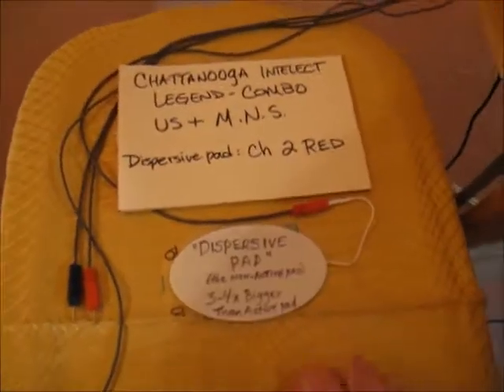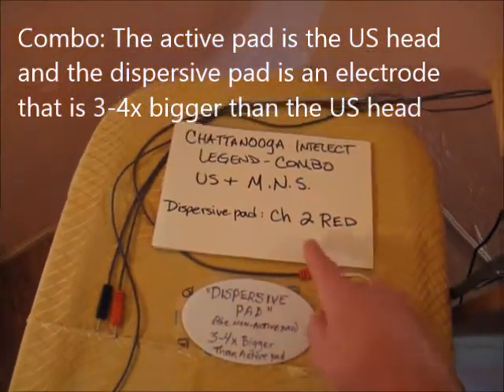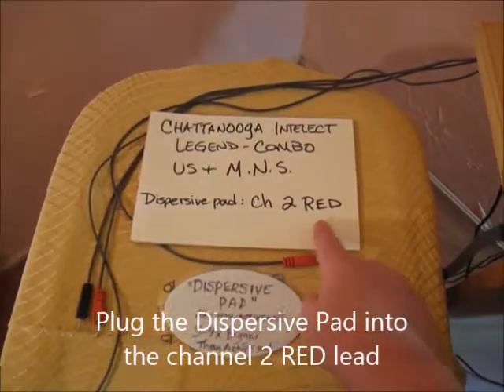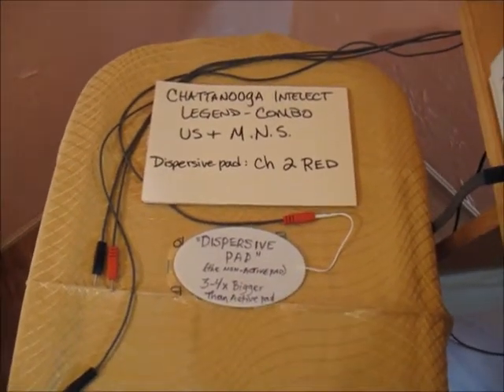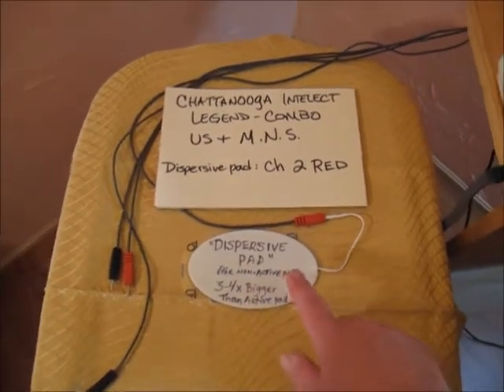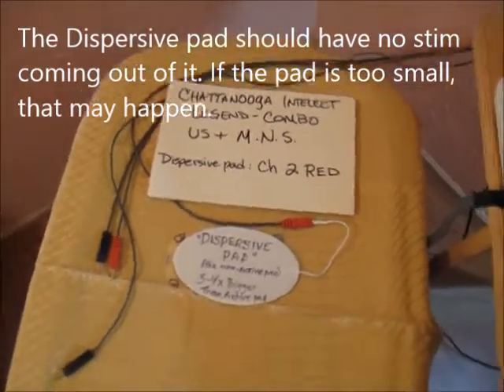Now set up the pads. The only pad you'll use is a large pad. Make sure it's plugged into channel 2 red on this Chattanooga Intellect unit. This big pad will be placed on the low back, upper back, anterior thigh, or posterior calf. There should be no stim coming out of it, though sometimes there is if the pad isn't quite large enough.